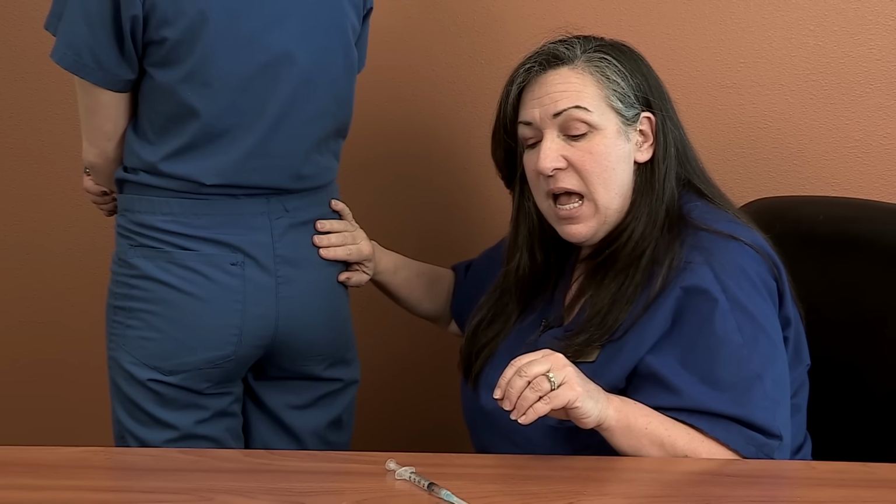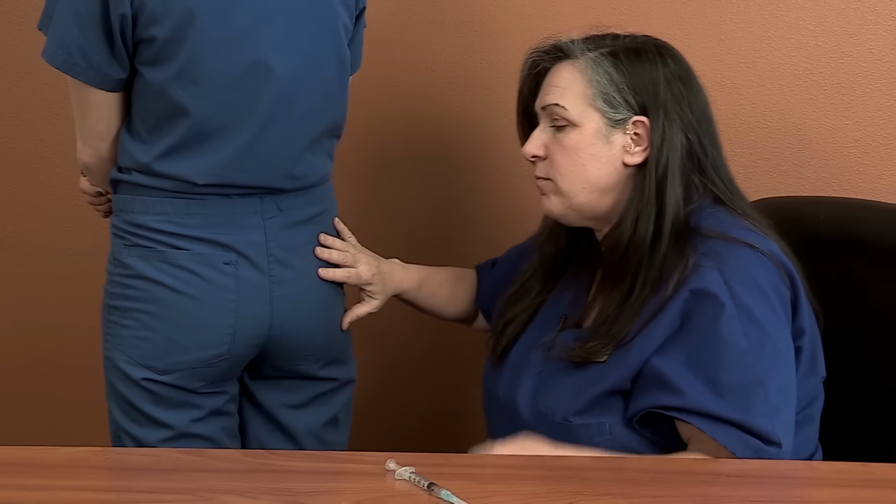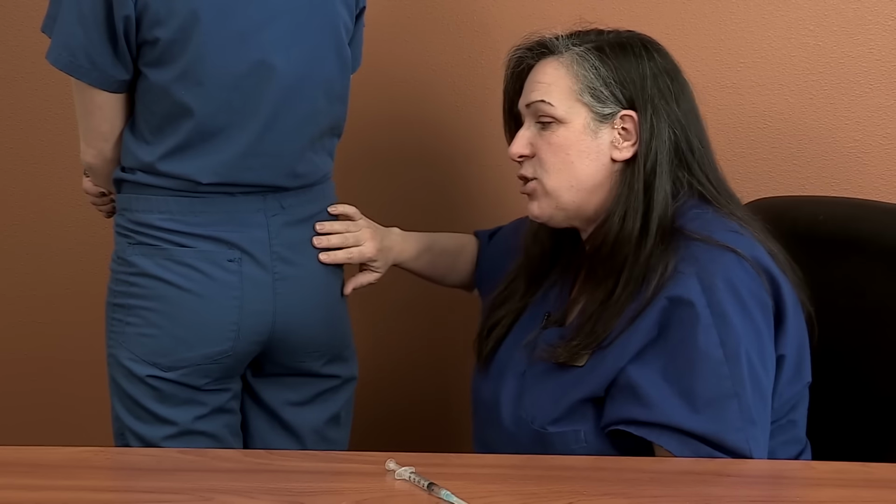Now, there are really only 2 parameters to do this injection. And most often when I have folks who have been on this shot for a few days or a week, and they tell me, this is terrible, it's horrible, I can't do it anymore, I'll tell them, come on in, let me take a look. They're usually still in cycle with me and I can see them. And invariably I'll find the position is wrong. Not wrong for me per se, because quite honestly, this is all muscle back here. So you're getting your medication, but invariably it's in the wrong spot, and that's why it's hurting so much, usually after.